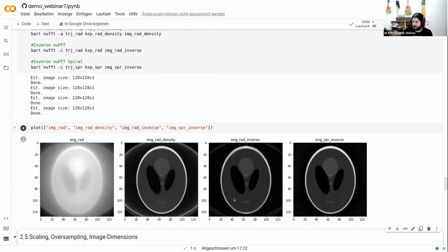Yeah, I just want to point out the comments so everyone sees. Kwanjin, you mentioned that you weight the k-space data with the adjoint reconstruction, and you use that as a density compensation. Is that my understanding? Yeah. That works better than the inverse.